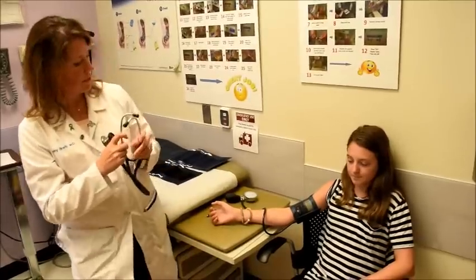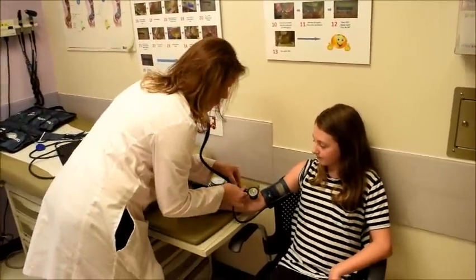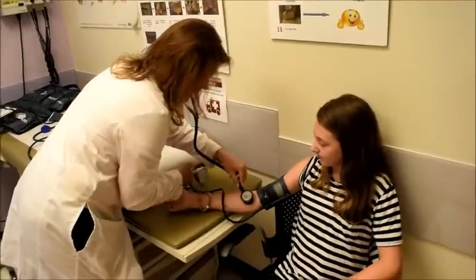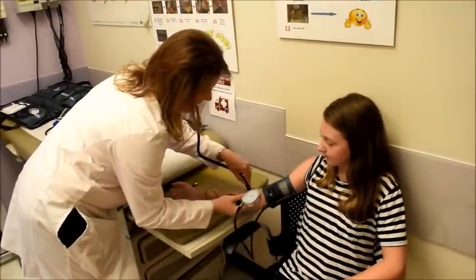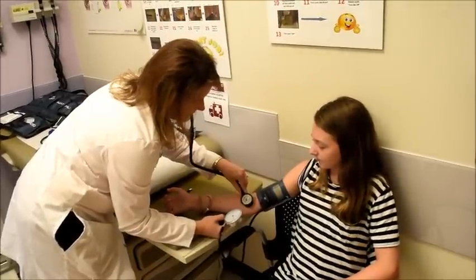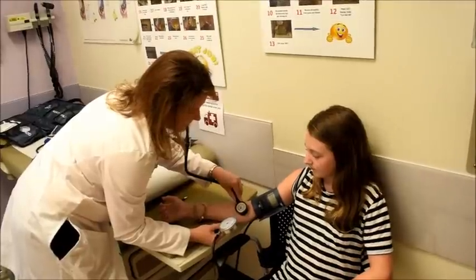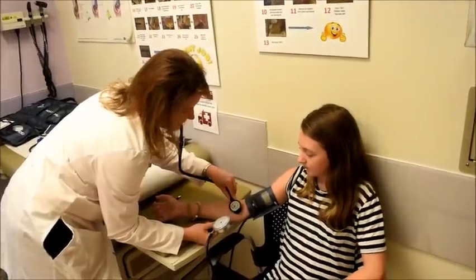So we're going to get ready. We're going to measure her blood pressure. We're going to put the bell right over the brachial artery. We're going to inflate the sphygmomanometer to 60 quickly, and then to the peak inflation level. And then we're going to deflate by 2 millimeters of mercury a second until we hear the sounds.